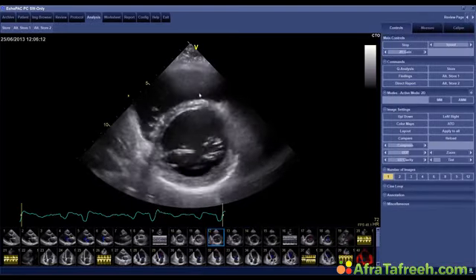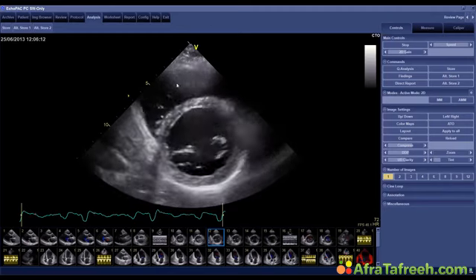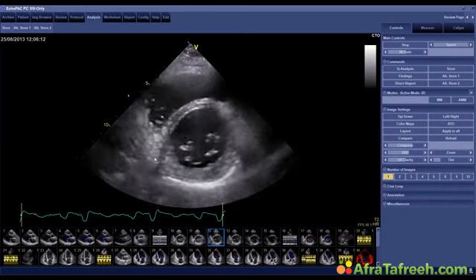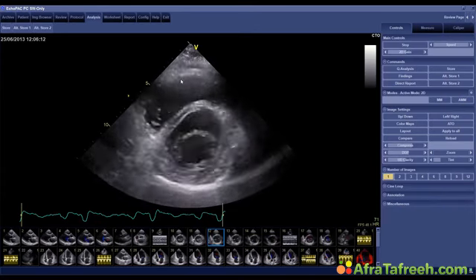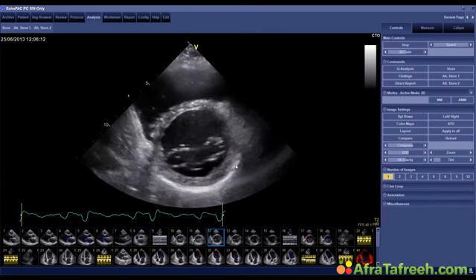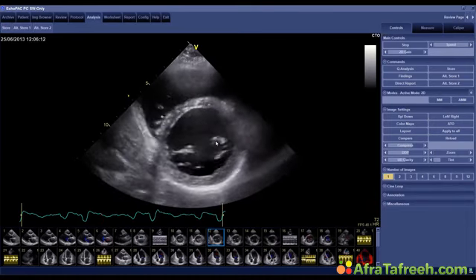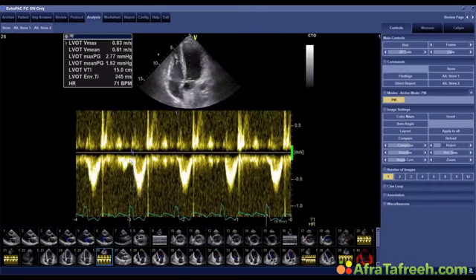Look, here you see this abnormal septal motion. You see this? Okay. Now, the patient has pulmonary hypertension, but it's not very severe. Why does he then have abnormal septal motion? The answer is so simple. It's because the pressure in the right ventricle is still so much higher than the pressure in the left ventricle, because the pressure in the left ventricle is so low. Why is it low? Because the patient has low output, right? There is no flow here, and he was very hypotensive.